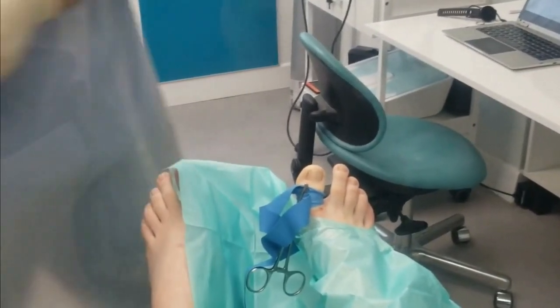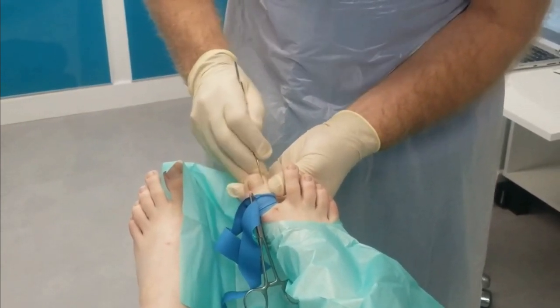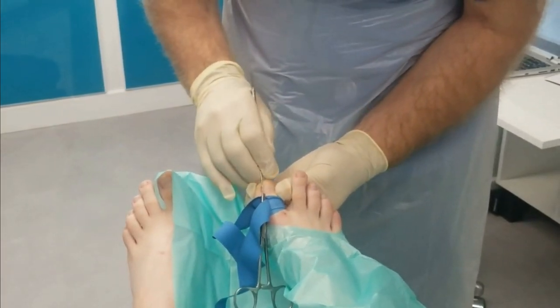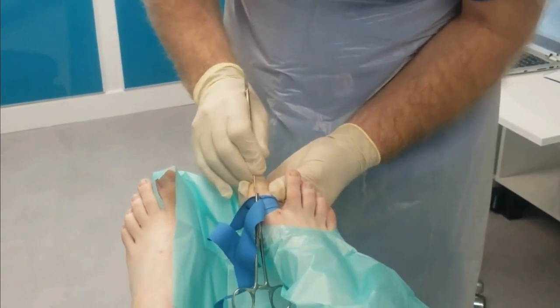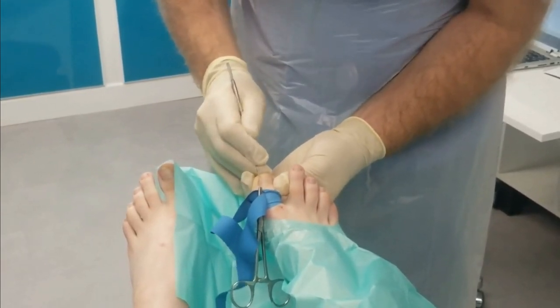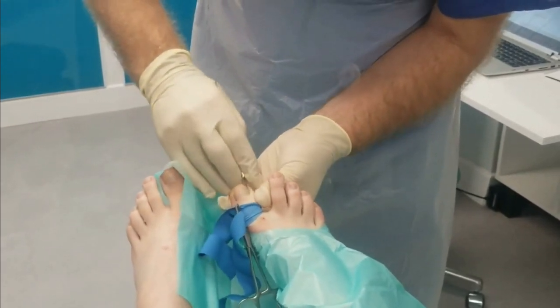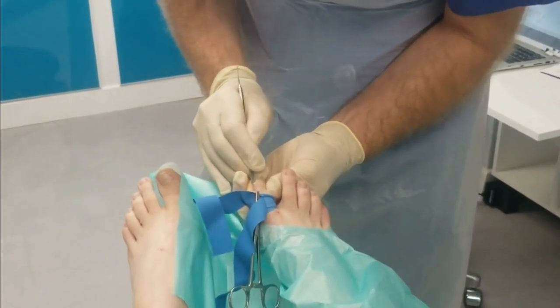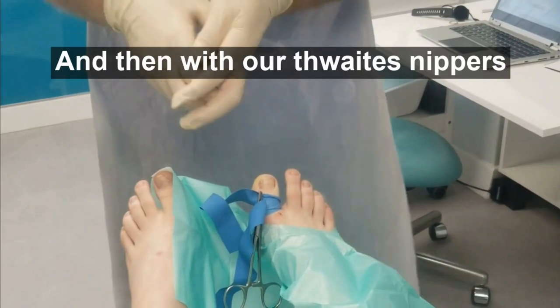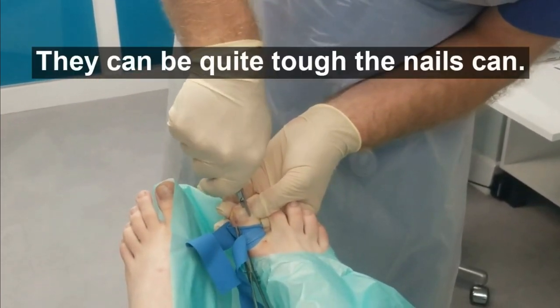We then need to elevate the nail on the edges where we're going to be taking it out. Bear in mind this is a completely numb toe — the patient's not feeling it at all. Just separating it from the nail bed, and then with our nail snippers cutting down the nail — they can be quite tough to cut through.